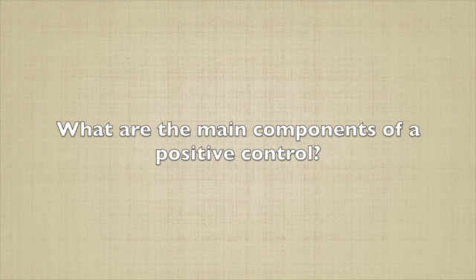This model also has the capability to model positive control. In a positive control, the model utilizes similar components as the patient's sample, where it will have the correct primary antibody and secondary antibody combination present that is capable of binding the target antigen.